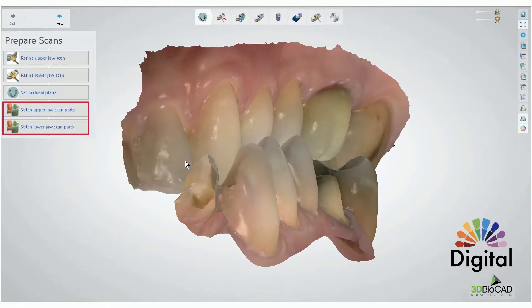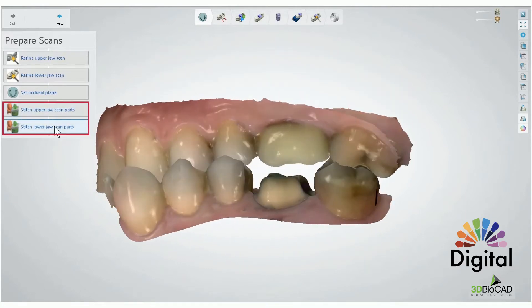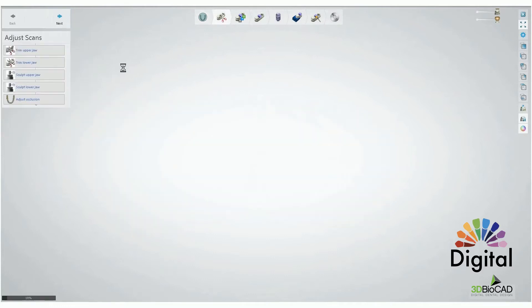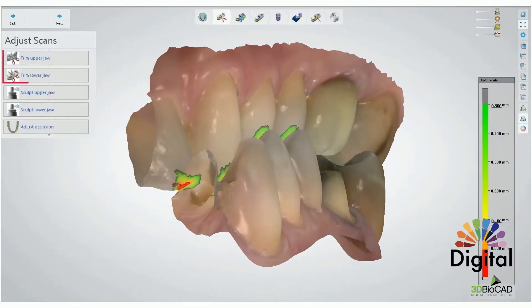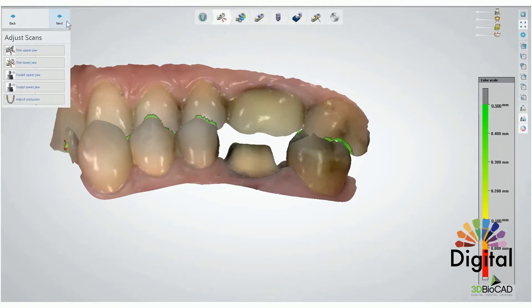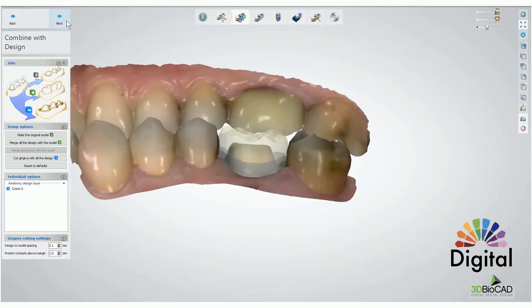Stitch Upper Jaw and Lower Jaw Scan Part — these two steps can be skipped if you don't have an extra part to stitch on your scan. This is a normal single case so we don't have to care about it. Trimming Upper and Lower Jaw — we already did this in crown design so no need to trim anymore. If needed you can, but if not you don't have to. We can skip and go next.